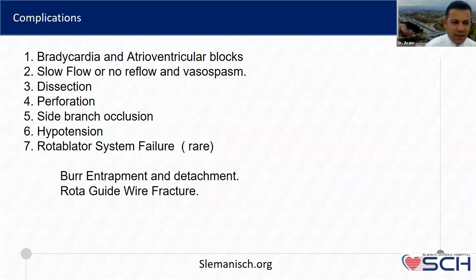We have got a long list of complications. This is the most important part of the presentation, but I definitely don't want the presentation to be boring. I will try to cover some of them, because some of them, like bur entrapment, need a lot of technique. If we're going to talk about them, we need 2-3 lectures. But I will try to cover simply the important points in dealing with the complications.